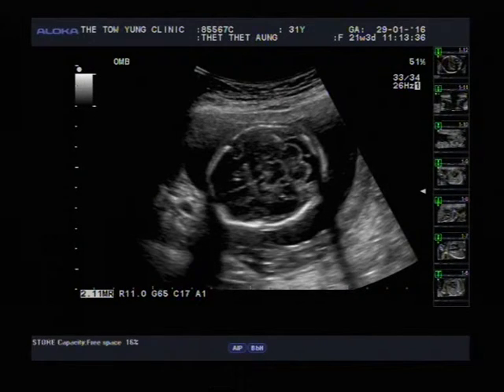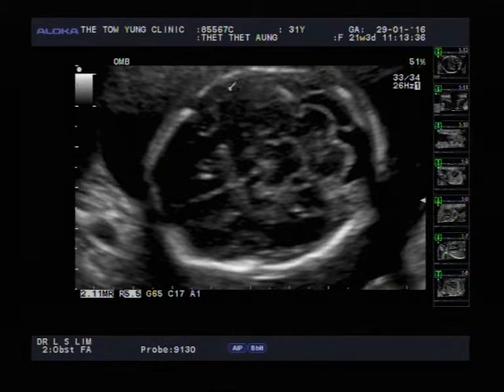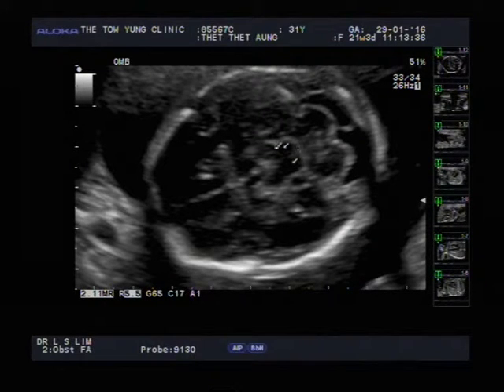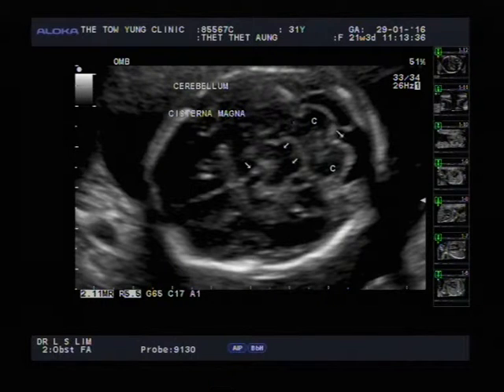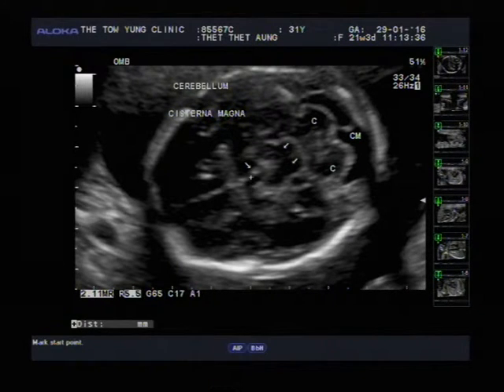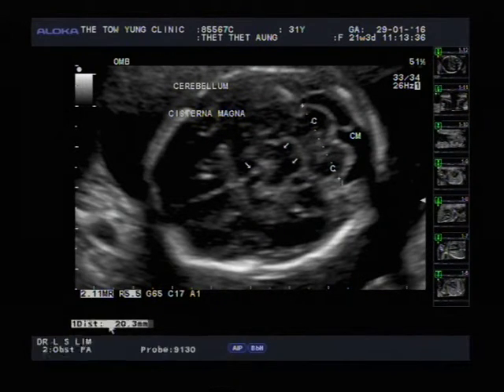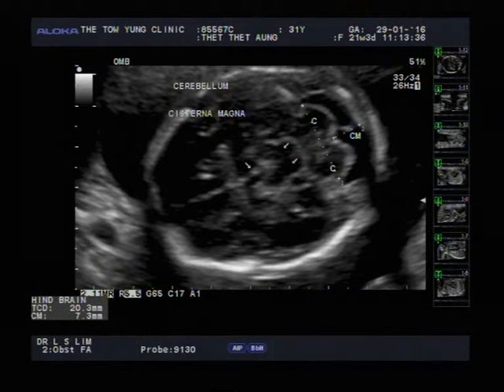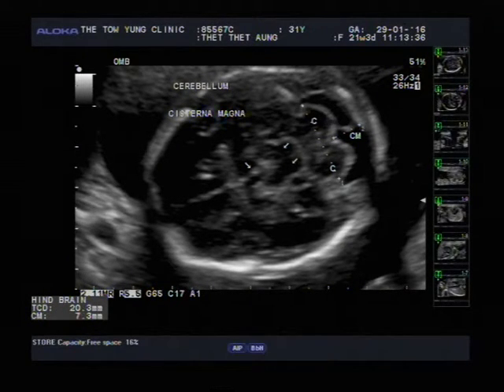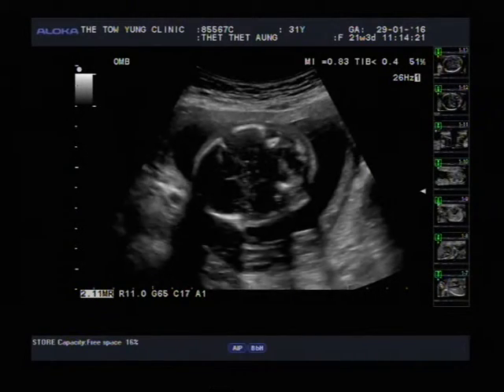This measurement should be less than 10 millimeters — 6.6 millimeters is normal. Anything more than 10 would mean there's too much water in the brain. This view shows the posterior brain. We're looking at the cerebellum and the cisterna magna. You can see the thalamus on both sides and the midline falx cerebri. The cerebellum is made of two lobes. Behind the cerebellum is the cisterna magna. The transcerebeller diameter measures up to 20 millimeters — normal — and the cisterna magna measures 7.3 millimeters — also a normal reading. The baby's brain is okay.